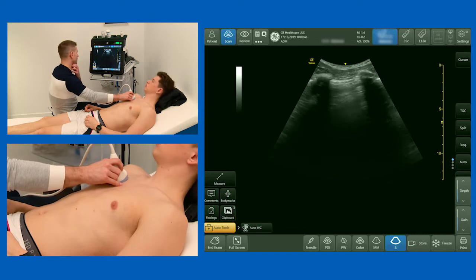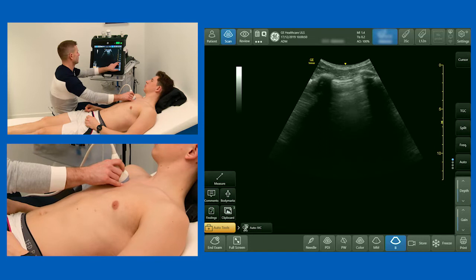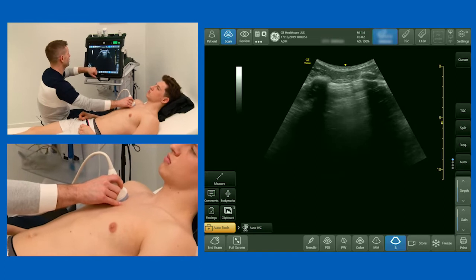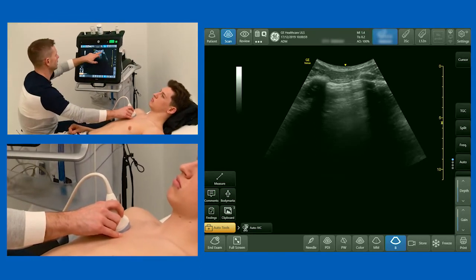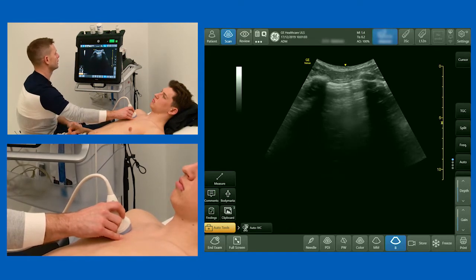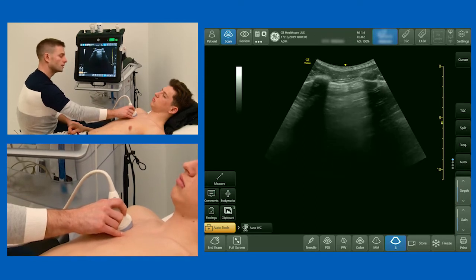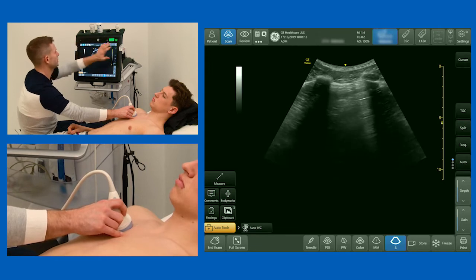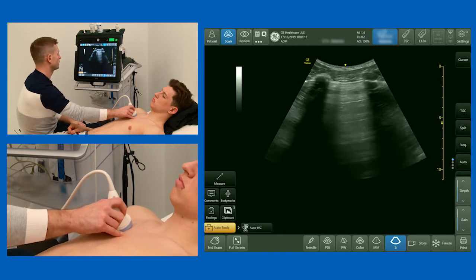And we get an image like this. The first thing we're looking for is the bat sign. We can see some soft tissue under the probe, a rib here with a shadow underneath it, another rib with a shadow, and then a bright white line about half a centimetre below the rib, which is our pleural line. For reference, this is the head end of the patient and this is the foot end — cephalad and caudad — which is just ultrasound convention.